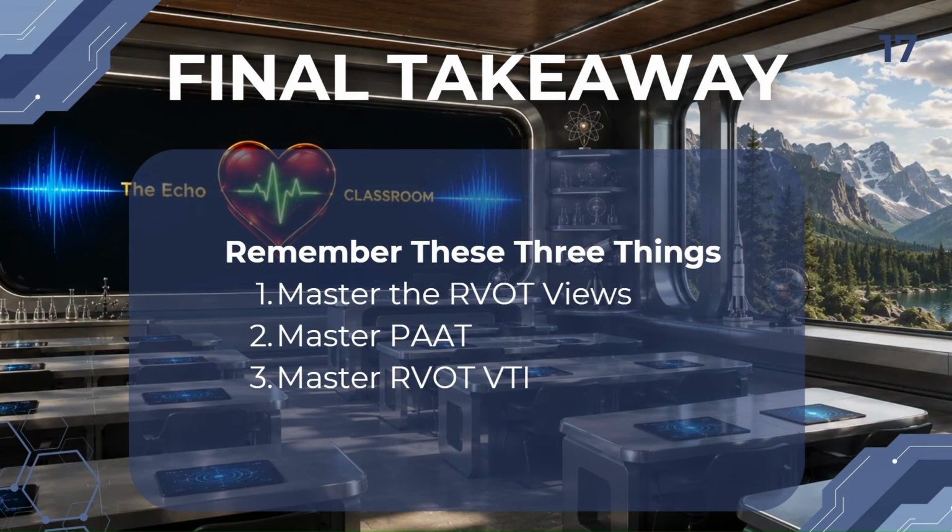The pulmonic valve is far more than a quick color Doppler clip. A complete pulmonic valve examination provides valuable information regarding pulmonary pressures, pulmonary vascular resistance, stroke volume, right ventricular function, and valve pathology. Master the views, master the measurements, and you'll dramatically improve your scanning, confidence, and your understanding of right-sided heart disease.